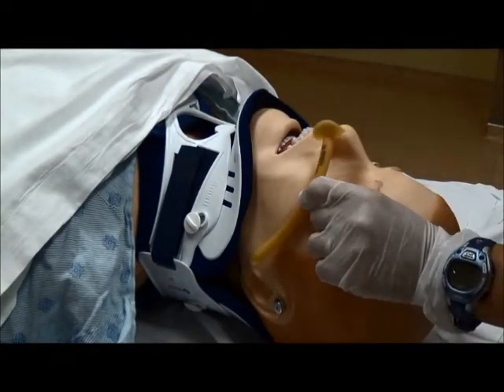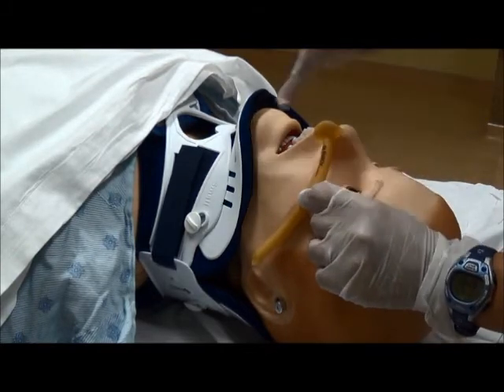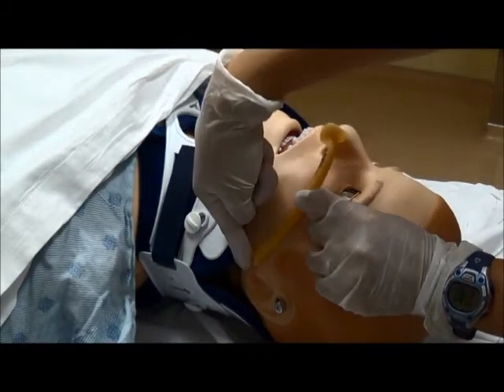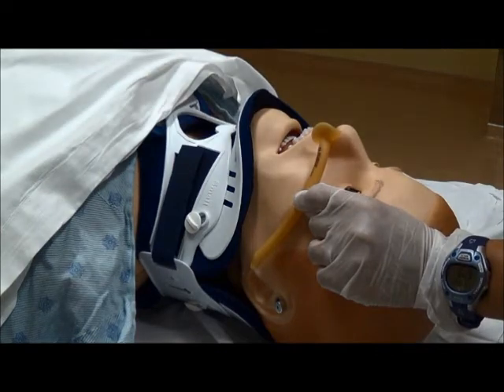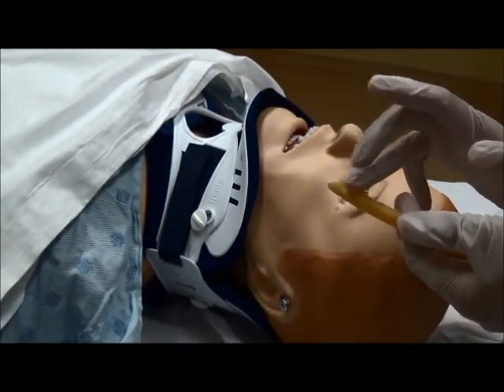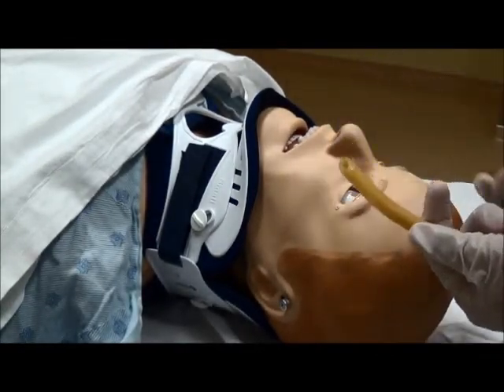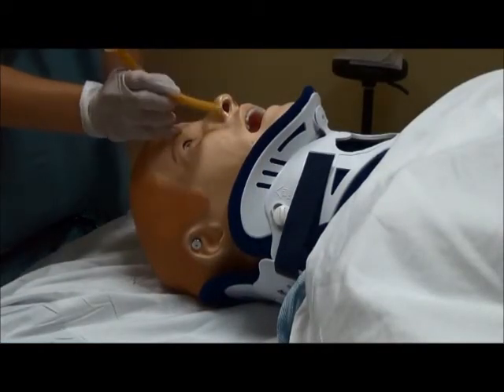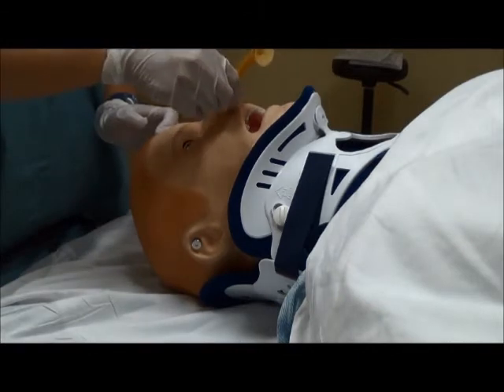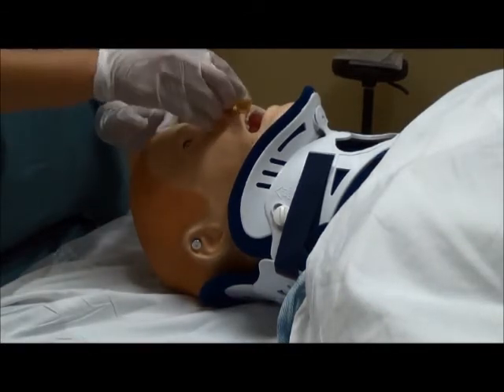First, find the correct size for the patient. The length should be the distance between the patient's nostril to the angle of the mandible. Lubricate the nasopharyngeal airway. To insert in the right naris, point the bevel towards the septum and insert following the curvature of the patient's airway.